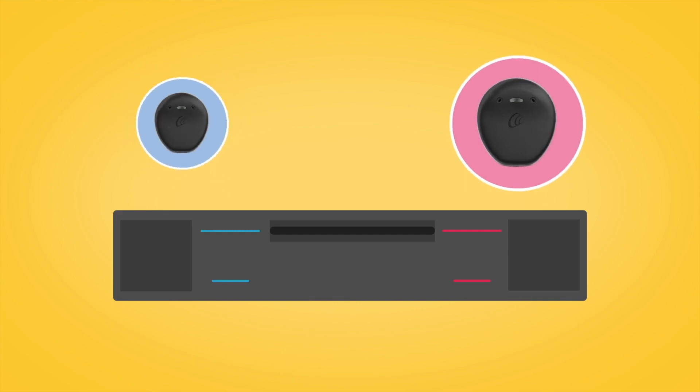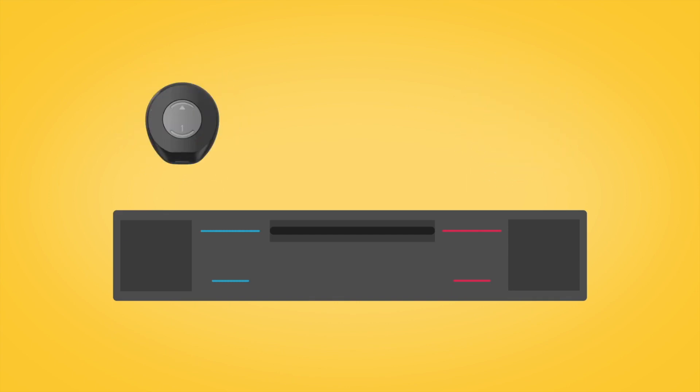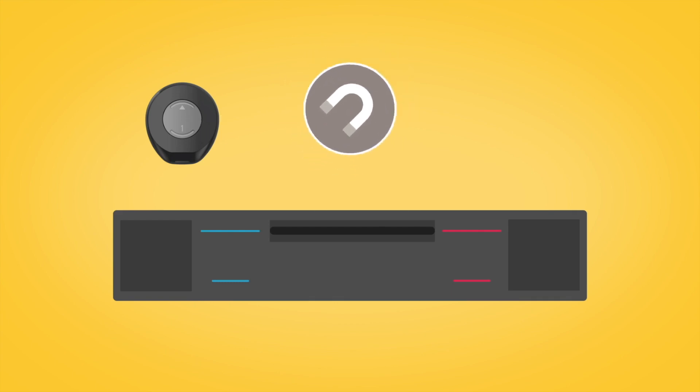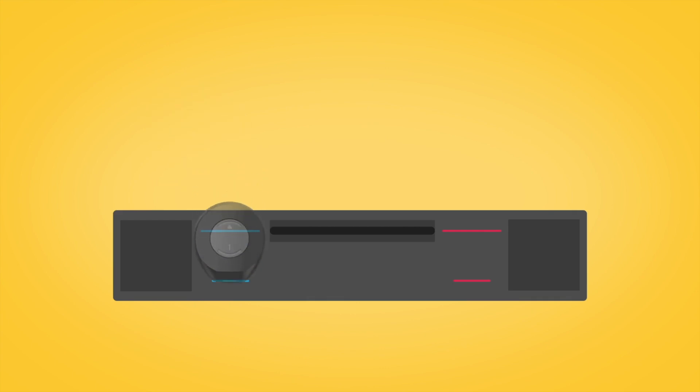Insert your sound processor into the pocket, making sure that the back of the sound processor with the magnet is facing towards you. The bottom of the processor goes in first. If you have two processors, place your second sound processor in the other pocket.